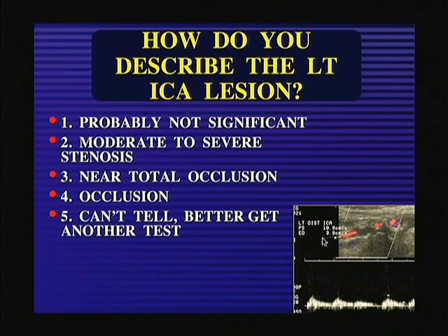We'll get another test. Now sometimes we just can't tell. And some of these cases are difficult. We may not see the vessel well to be able to make a specific diagnosis. And even if we're suspecting the diagnosis in this case, it might not be a bad idea to get another test to confirm that.